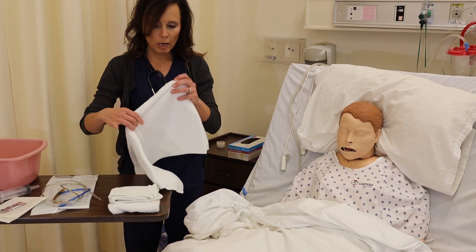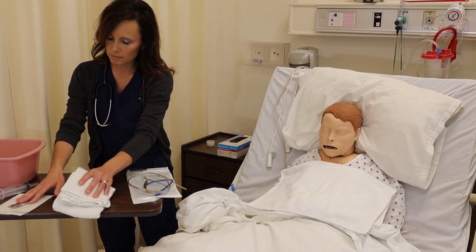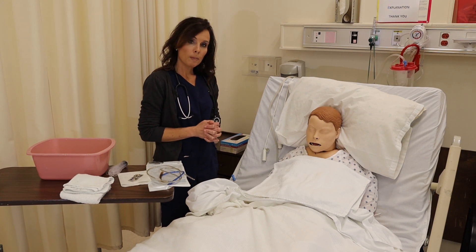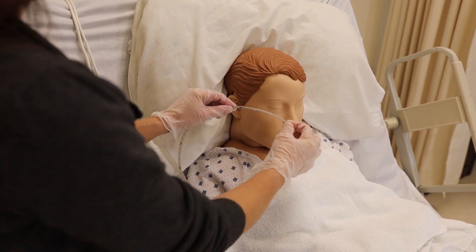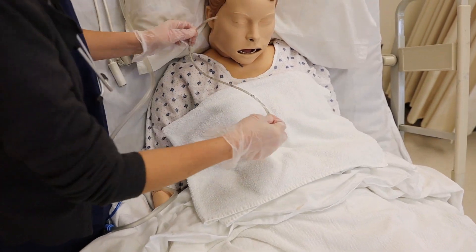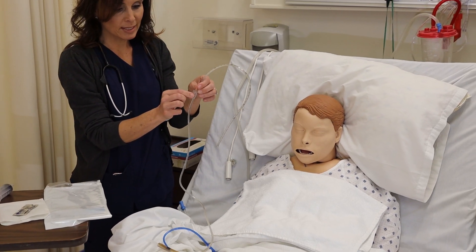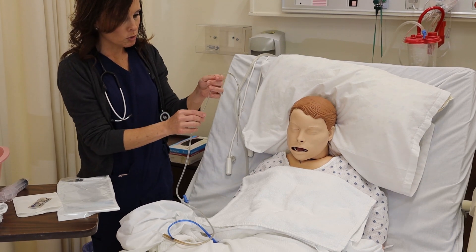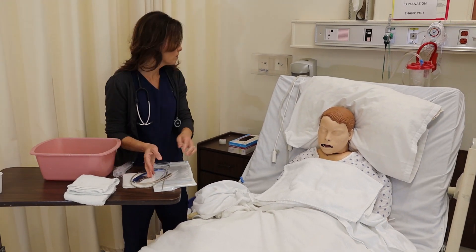We're going to go ahead and drape our client just in case they happen to get sick, and we'll bring our supplies close to us. The first thing we're going to do is measure our NG tube. We do this by taking the end of the NG tube, putting it at the tip of the nose, measuring to the tip of the ear lobe, and then down to the xiphoid process. For this client it's approximately 44 to 45 centimeters. You want to get some tape and mark your place where you will stop progressing — you could also do it with a permanent marker. Once we have measured, we want to wash our hands and put on our gloves.